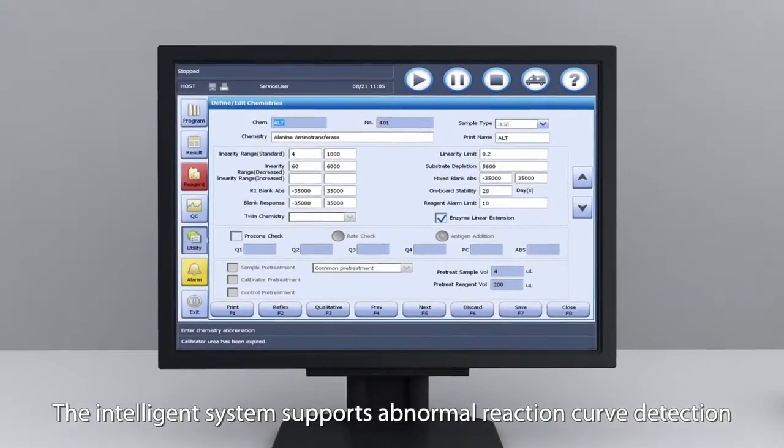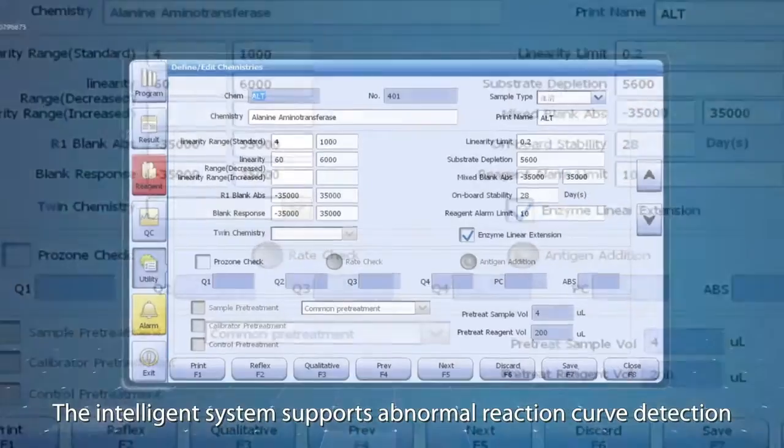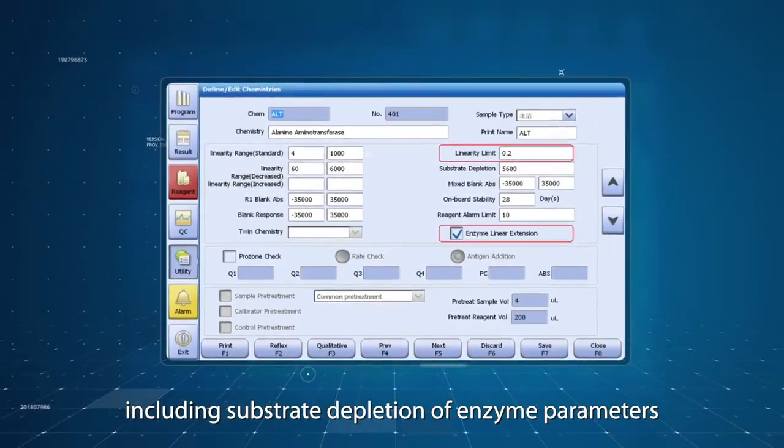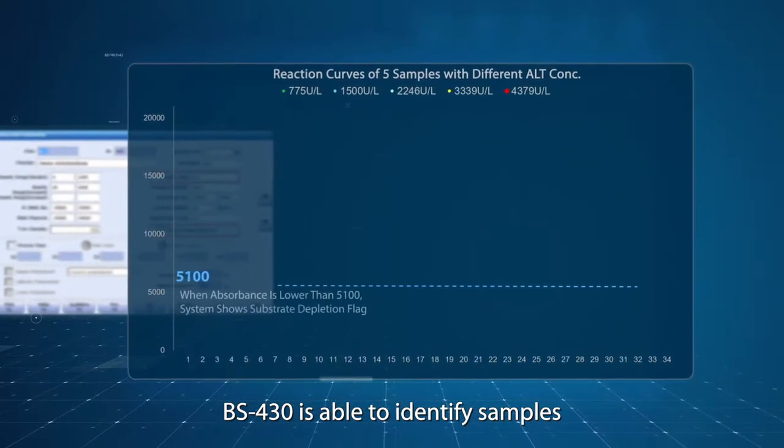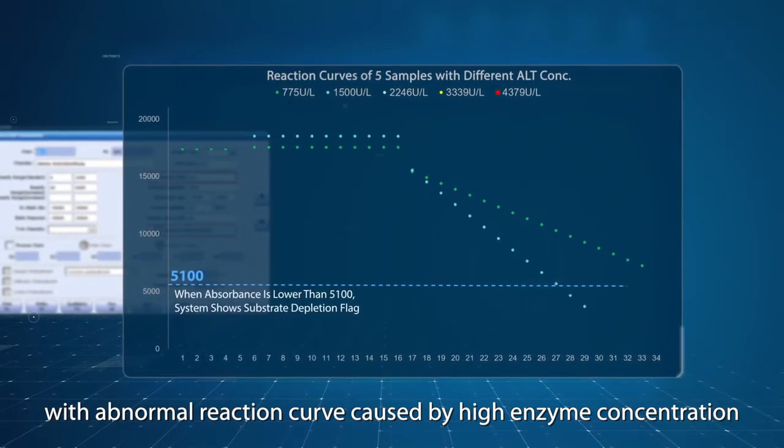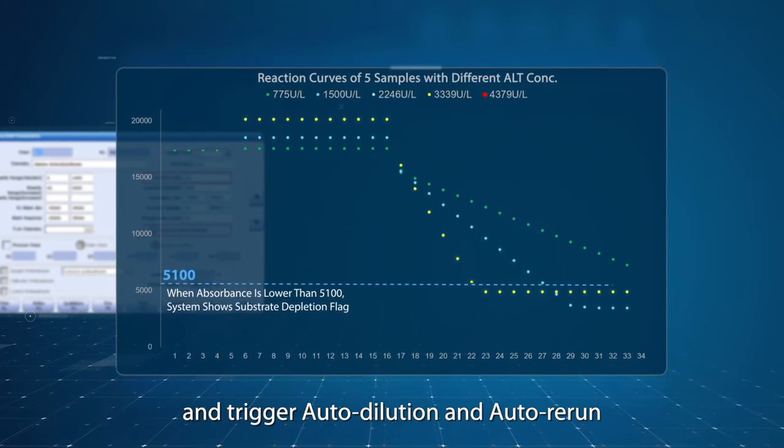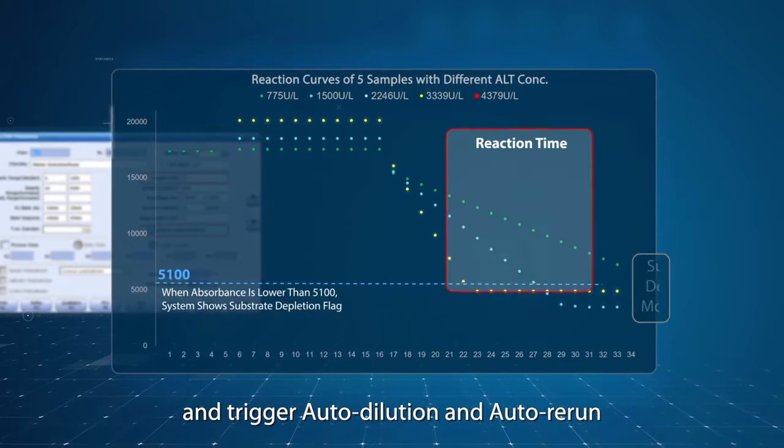The intelligent system supports abnormal reaction curve detection, including substrate depletion of enzyme parameters. BS430 is able to identify samples with abnormal reaction curves caused by high enzyme concentration and trigger auto-dilution and auto-rerun.